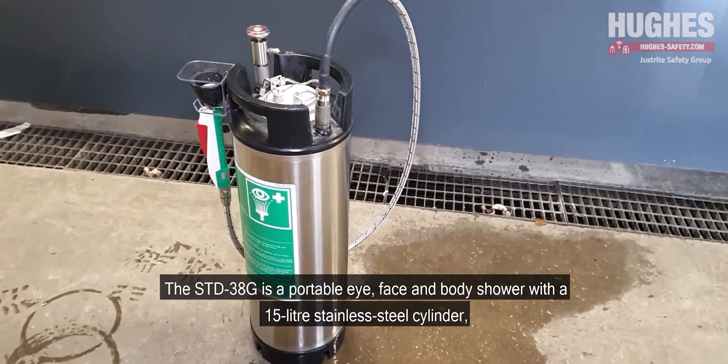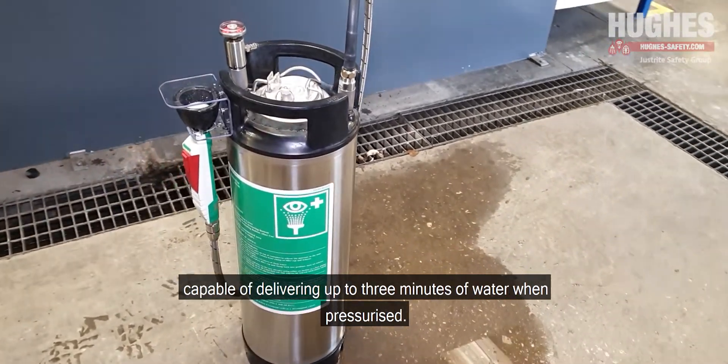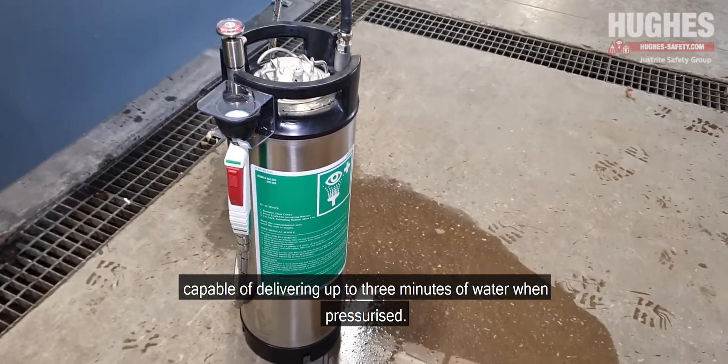The STD38G is a portable eye, face and body shower with a 15 litre stainless steel cylinder capable of delivering up to 3 minutes of water when pressurised.